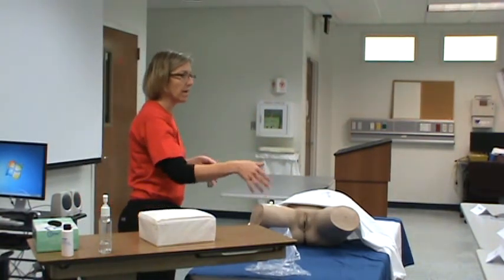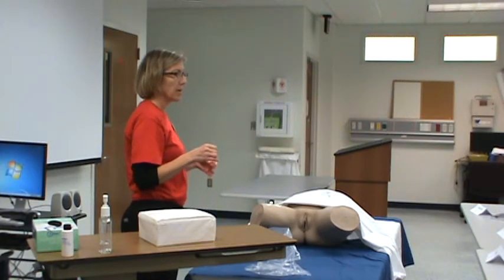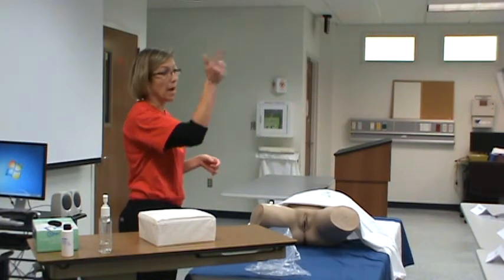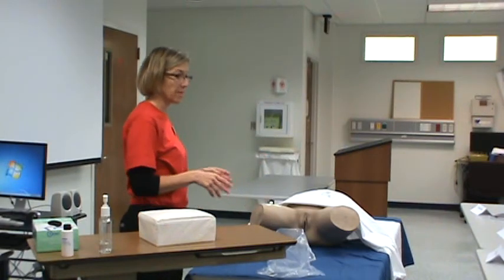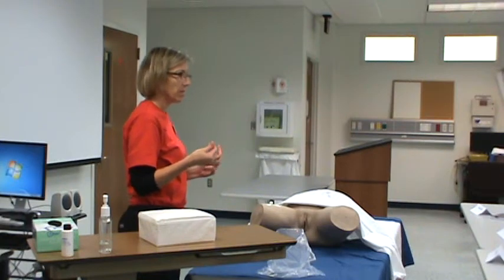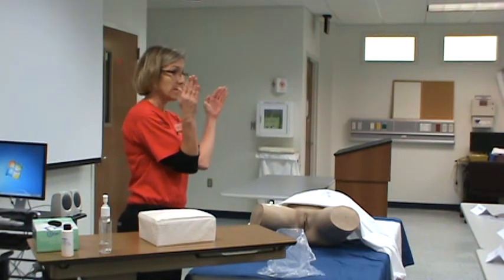Yeah, I've got it right there. What could a drawback be? It could fall under your shirt. Oh yeah, it could fall. I'm going to make sure it's far enough not to hit my sterile field, but it could fall. What else about contamination? Because in a minute I'm going to be sterile.